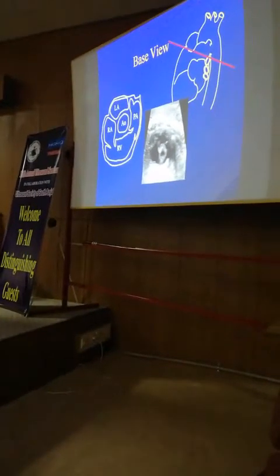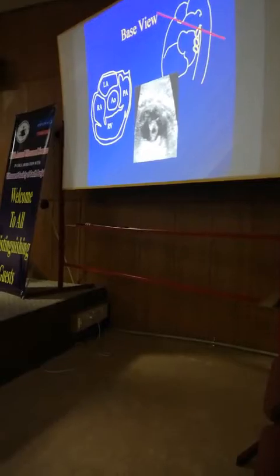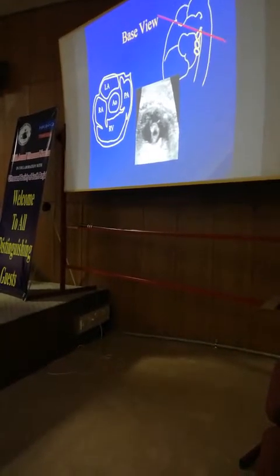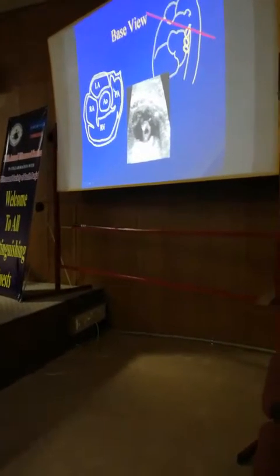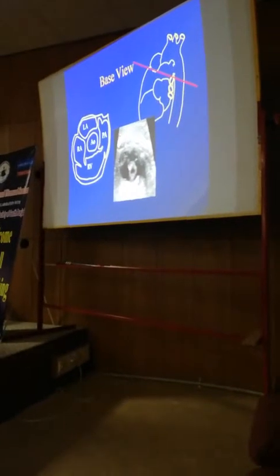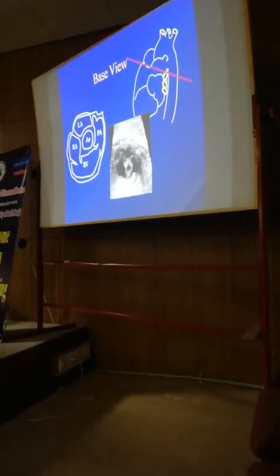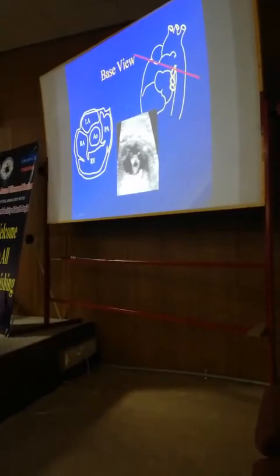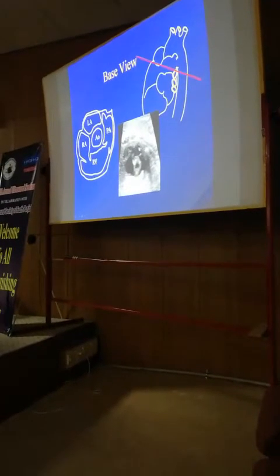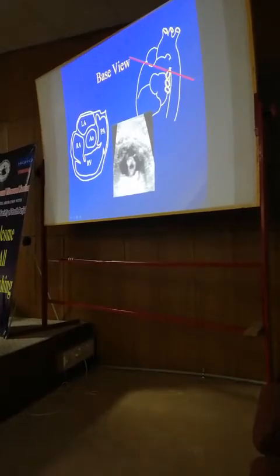All right. So we have done the four-chamber view. We've done the outflow tracts. We've seen that the outflow tracts are crossing at 90 degrees. अब इसको हम थोड़ा सा ऑफ कर देंगे. तो हमें ये चीज़ होगा. The aorta in the middle and the pulmonary artery and the bifurcations around it. So this is what it is. Right ventricle, right atrium, left atrium, pulmonary artery, bifurcation.